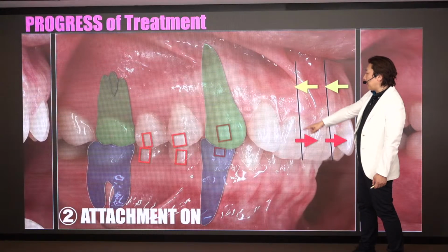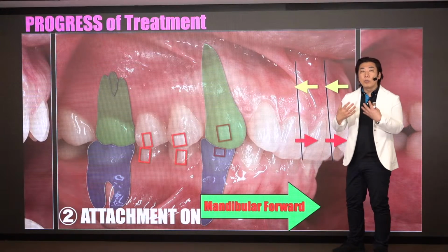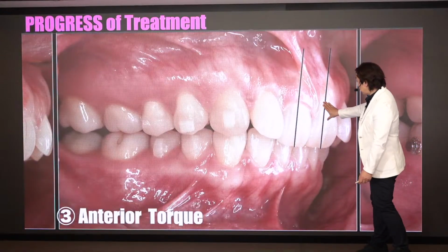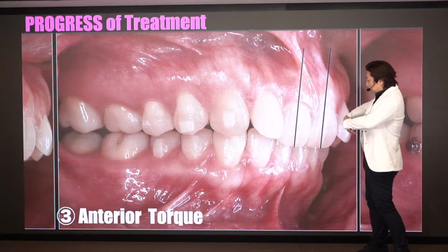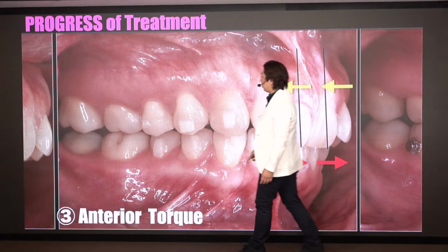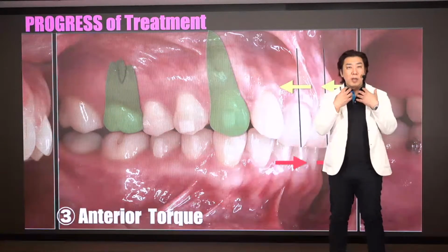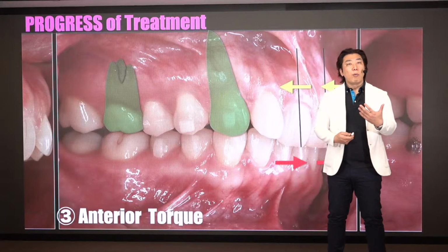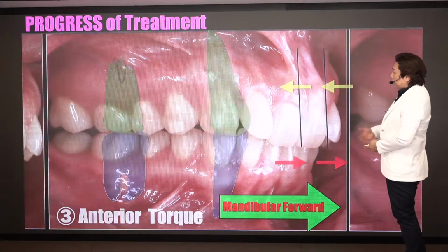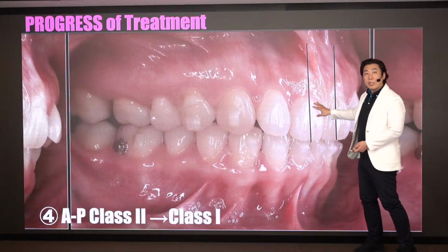This is the upper and the canine position, almost still there. Then just a little bit the mandible goes forward, naturally. This continues as the upper anterior teeth increase in proclination. As you can see, there is just a little bit of change in the molar position and the canine position too. This is natural. There is no need for the lower anterior teeth to move forward or for molar mesial movement. Natural tooth movement. Then, as you can see, the axis of the upper anterior teeth is totally different.